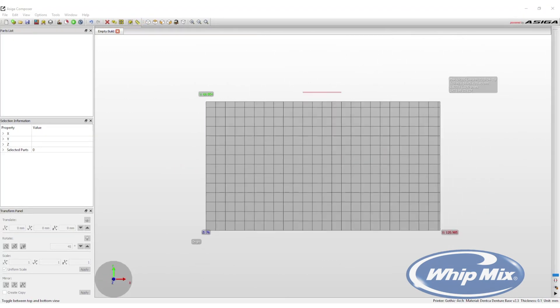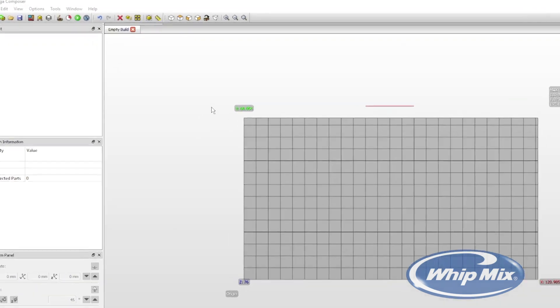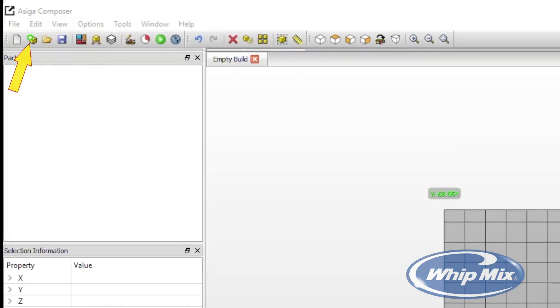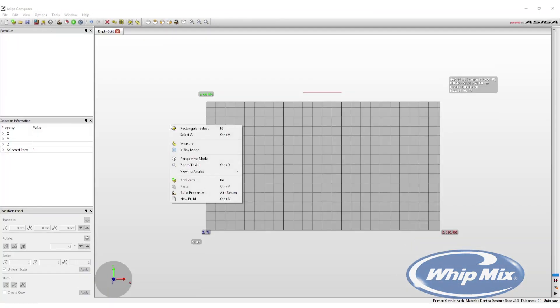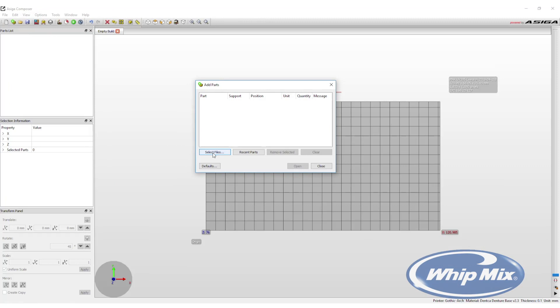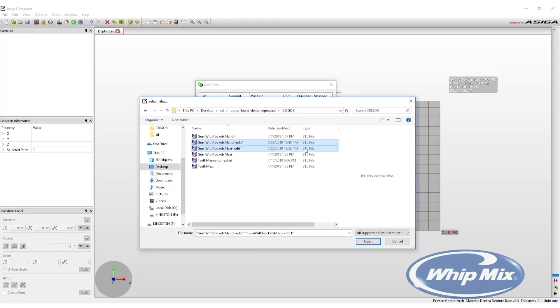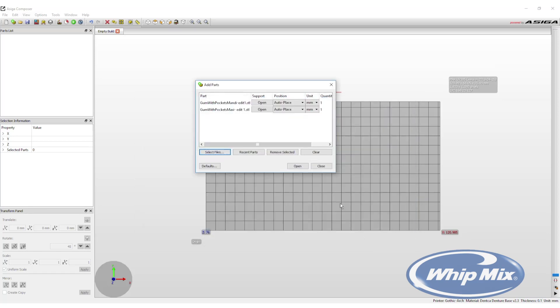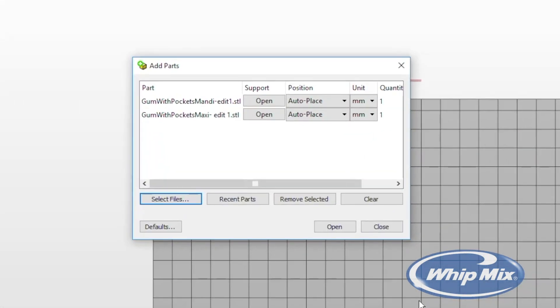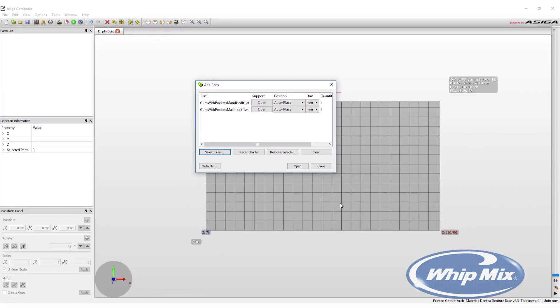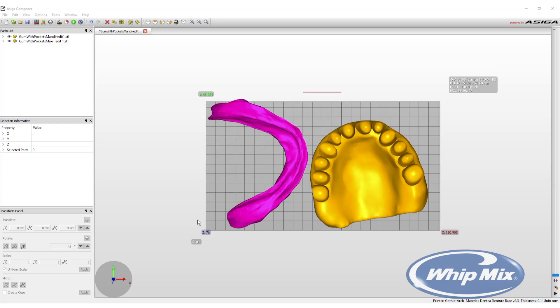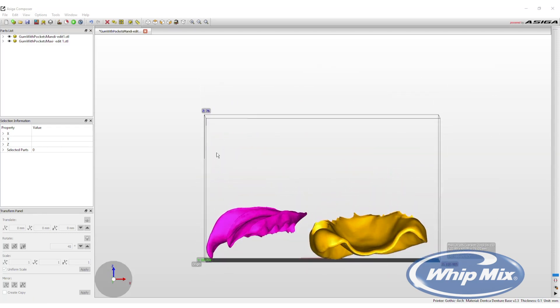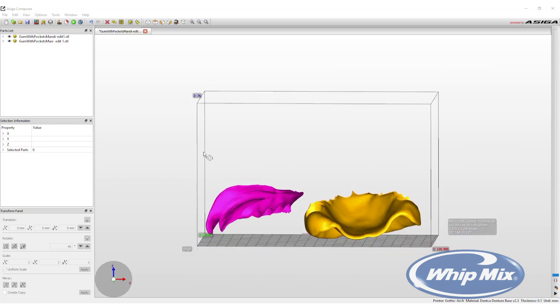There are two ways to import STL files into the build: select the Add Parts button on the toolbar, or right-click on the screen and select Add Parts. From the Add Parts window, press the Select Files button, locate the denture base files on the computer, and select Open. More than one file can be selected at a time. Once all files have been selected, hit Open again to add the files to the build.